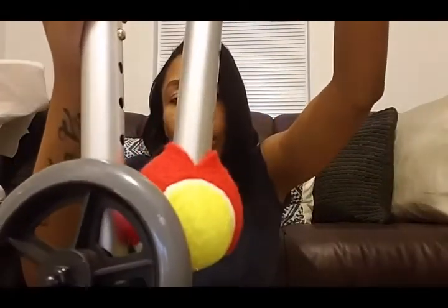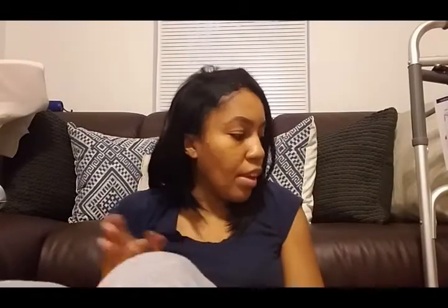So this is what it looks like without the tennis ball, and this is what it looks like with the tennis ball around it. Basically, when I used it without the tennis ball, it scratched up my floors a little bit, and when I made turns with the walker, it wasn't too easy to turn. So what the tennis ball does is it allows the walker to move smoothly. If you're going somewhere, it's an easy glide across the floor. It's not going to scratch up your floors, and it's not going to be hard to navigate.